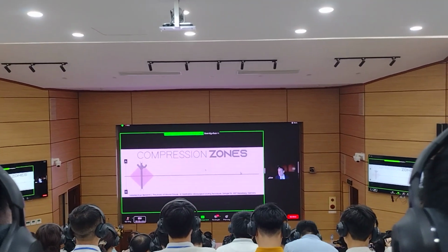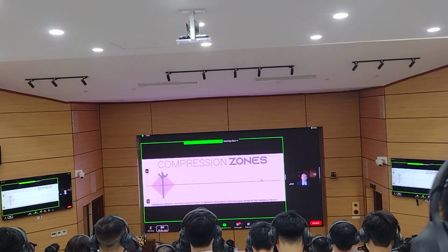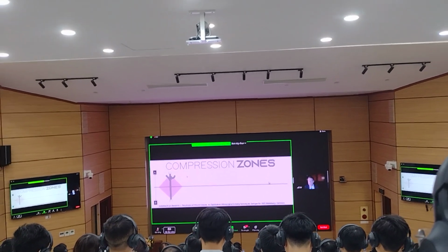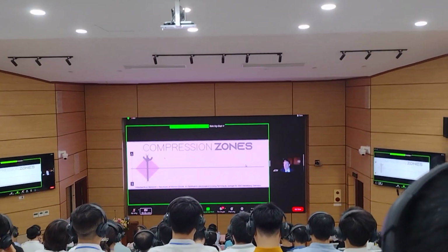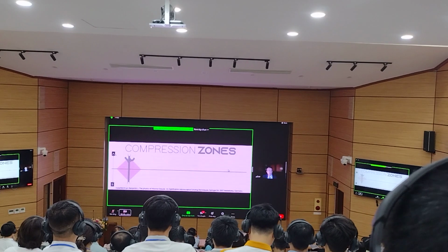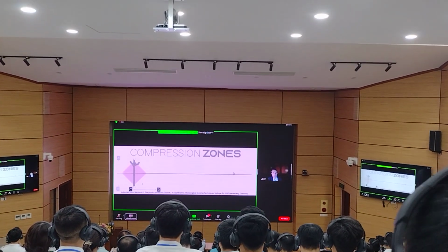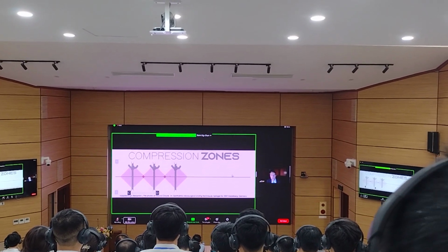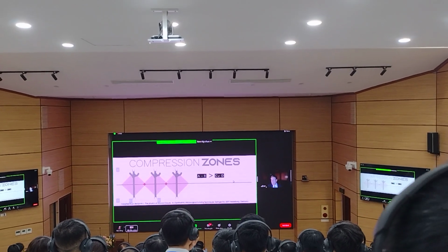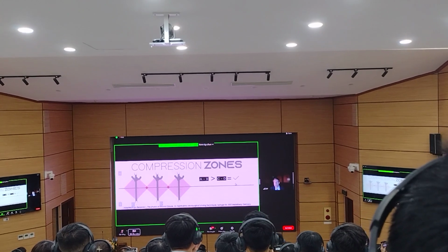And there is a concept that comes from the ophthalmologists that is called the compression zone principle. And it is a very simple principle that I would like to share with you for you to apply clinically when you go back to see patients the next time in your offices and at the school. Your entry point A to B should be larger than the distance in between the sutures that you are applying. When we have that type of relationship, we're going to have closure of these zones.